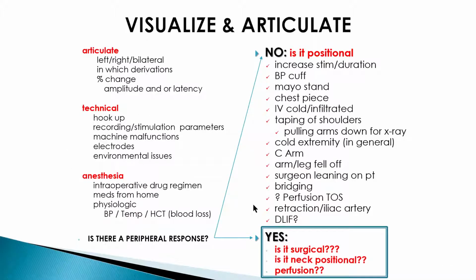You've probably seen this in other modules, but in addition to good policies, you should have troubleshooting flow sheets. In the heat of the moment, when everyone is standing over you and waiting for you to do your part after they took their time to do their part, wanting you to accurately apply 49 electrodes in 30 seconds, mistakes are bound to happen. With the anxiety of rushing, it's helpful to have these ready-made sheets because you may not think clearly in the heat of that moment.